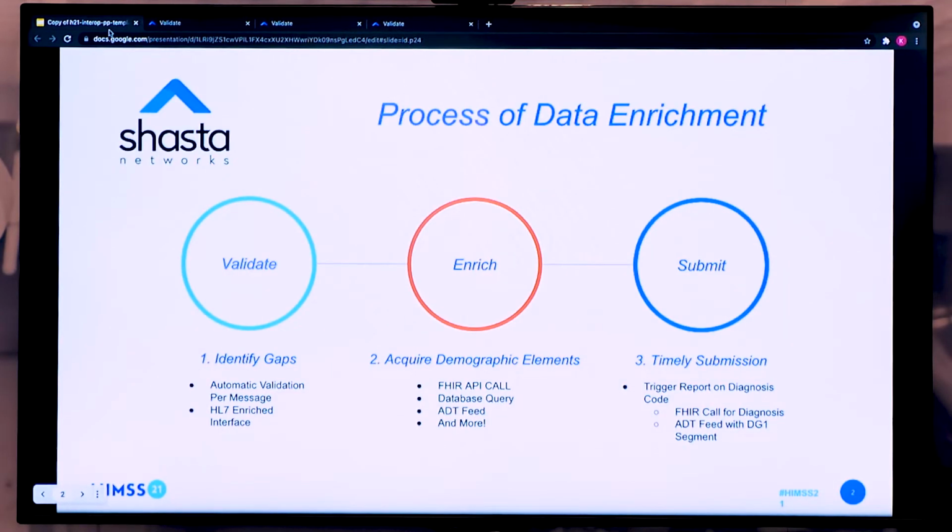Patient contact information is essential for the state registry when contacting the patient is required, and elements such as gender and ethnicity are needed for research, as well as for possible identification for clinical trials. Shasta will utilize the FHIR connection to the EHR to query for the demographic elements and then update the patient object. This can also be achieved by stitching together multiple V2 HL7 interfaces to provide a completed report, as is currently in production in California.